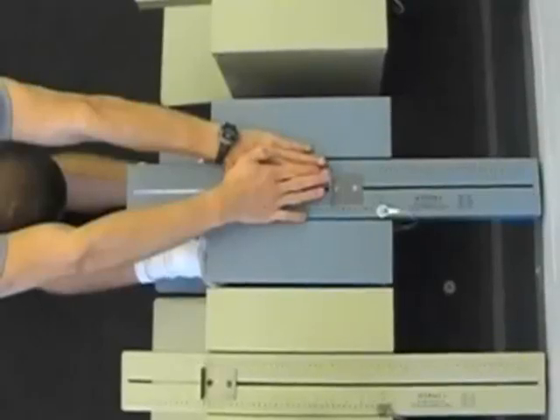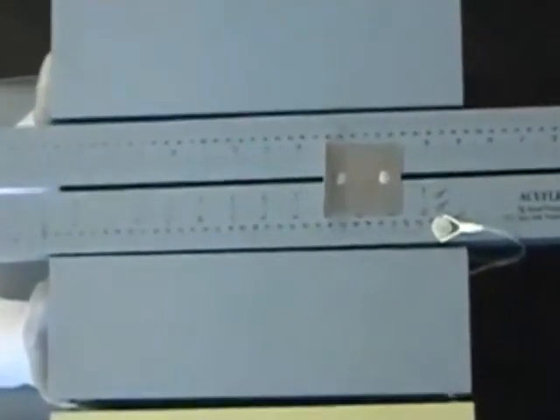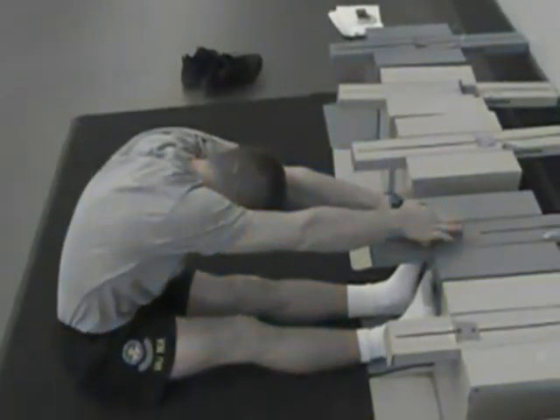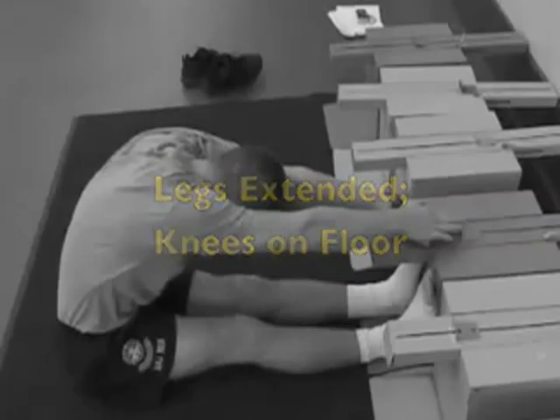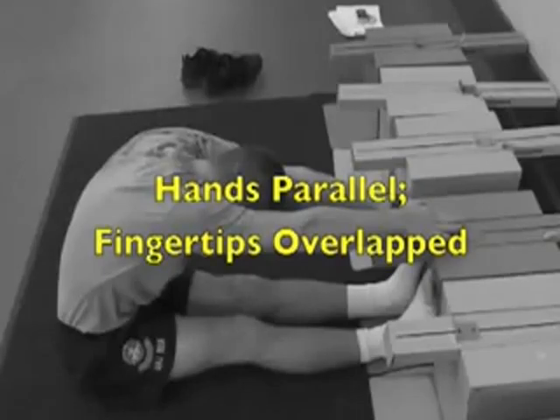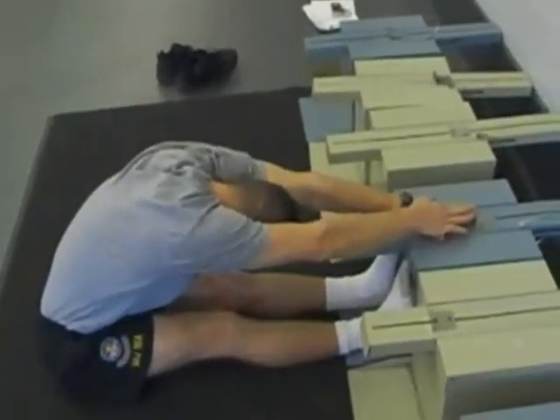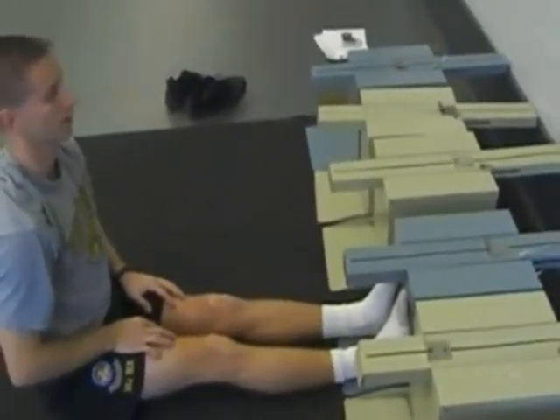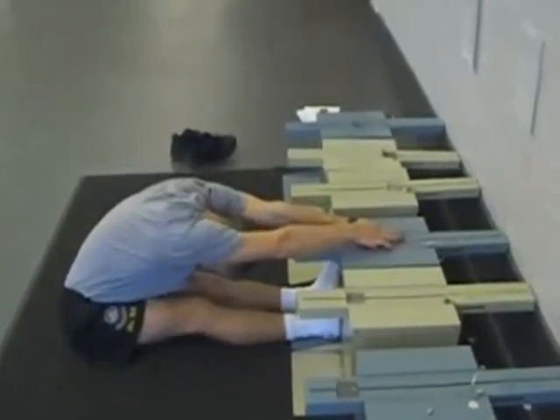Keep your legs extended with your knees on the floor throughout the exercise. Your hands should be parallel with the fingertips overlapped and in contact with the measuring portion of the box. The best attempt of all your trials will be recorded.